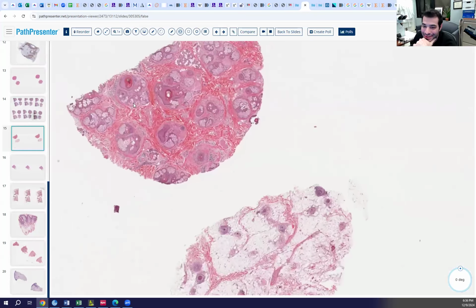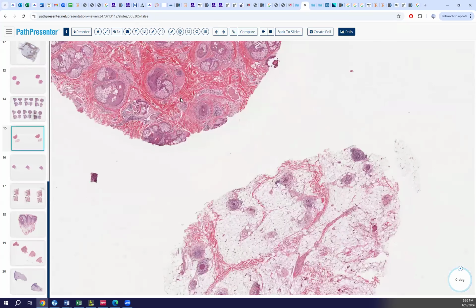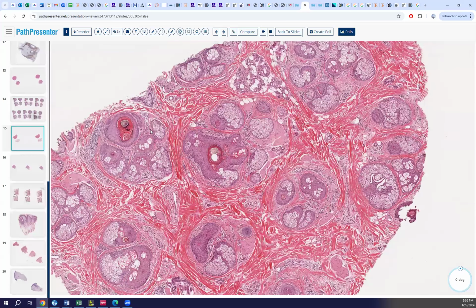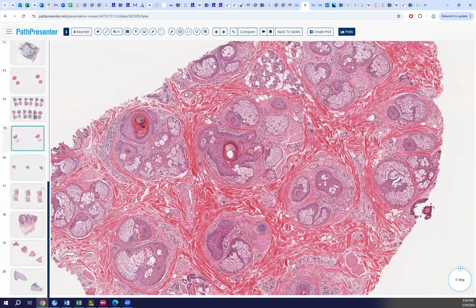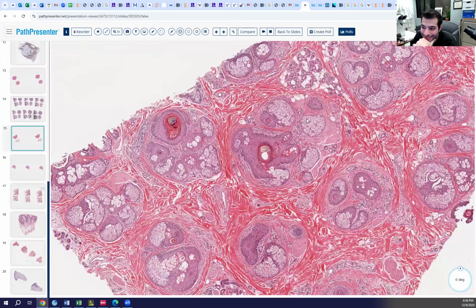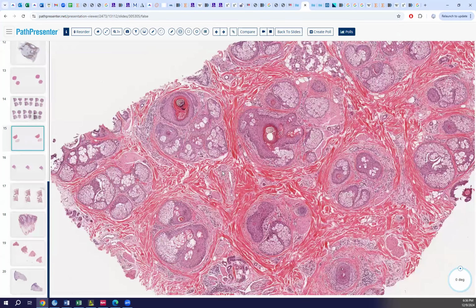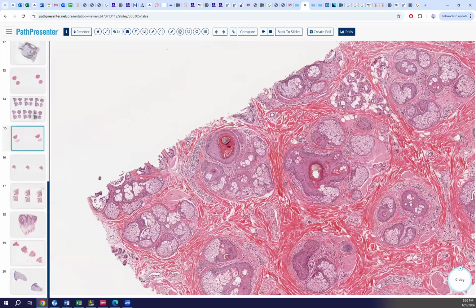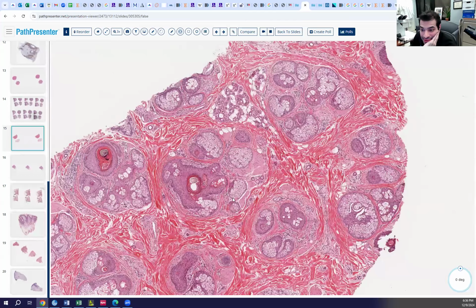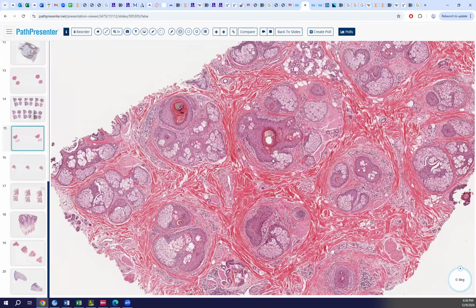Okay. Transverse section. Yep, transverse section, maybe at the level of the infundibulum. You have a lot of sebaceous glands. The hair follicles themselves are small. There's not a lot. They're miniaturized. We don't see a lot of inflammation at this level.